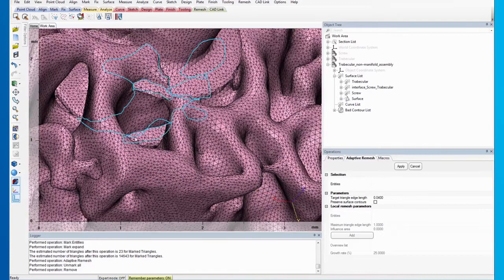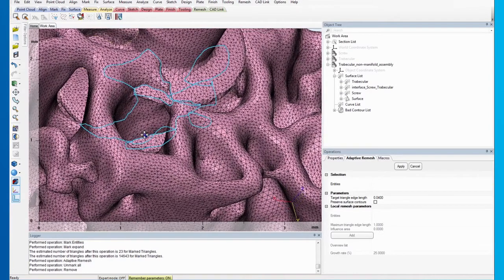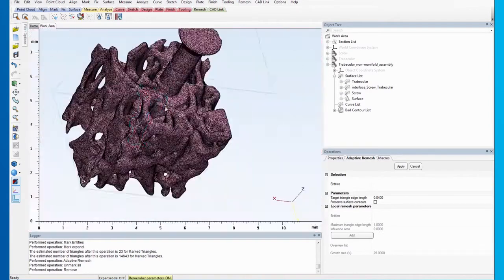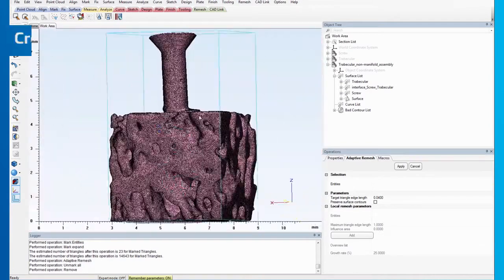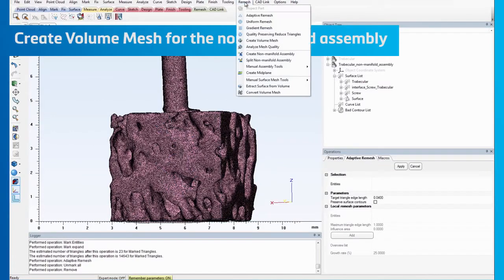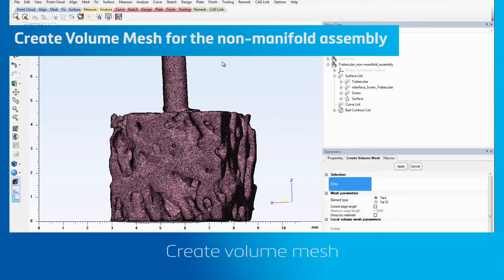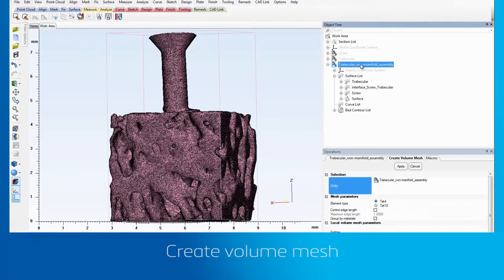Next, we will create a volume mesh for the non-manifold assembly. Go to Remesh and click on Create Volume Mesh. Then, select the non-manifold assembly as the entity.